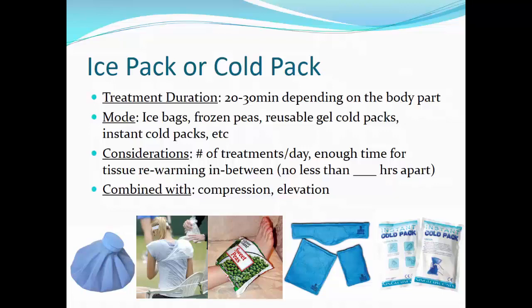The treatment duration depends on the treatment goal, target tissue, and the amount of subcutaneous adipose tissue. Typical treatments are approximately 20 to 30 minutes long depending on the body part. There are different modes of treatment which include ice bags, frozen peas which are just as effective as other resources, reusable gel cold packs, instant cold packs, as well as other resources.